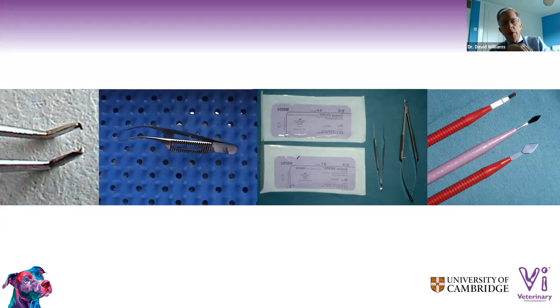Similarly with eyelids, hold them in one position and then just move with that going on. Then things like suture, we'll talk a bit more about suture later, but it's really good to have a small pair of Castroviejo needle holders there. And then as far as blades are concerned, there are lots of opportunities for disposable blades if you're going to go into corneal surgery or something like that. But maybe that's something for a future webinar on something a bit more specialized.